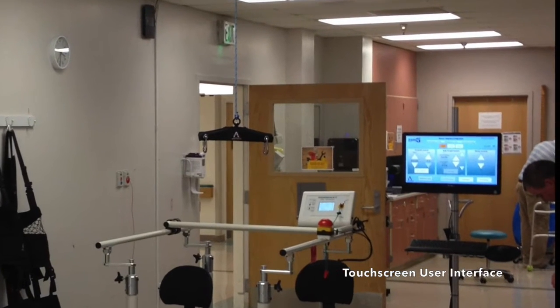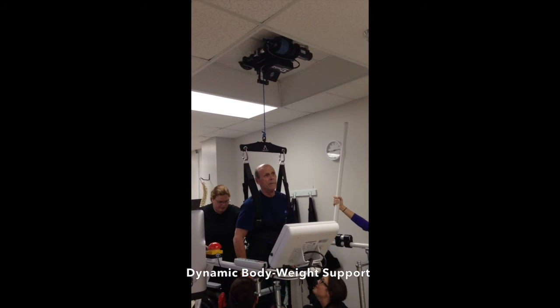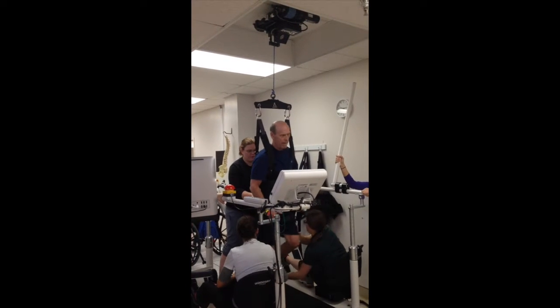Therapists may use either the touchscreen computer or a wireless tablet to control the Zero-G Lite. The dynamic bodyweight support of Zero-G Lite provides a consistent level of support even during vertical movements.